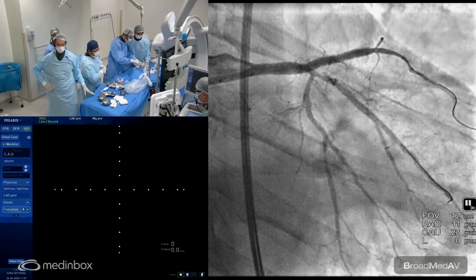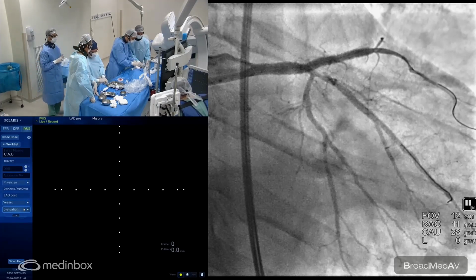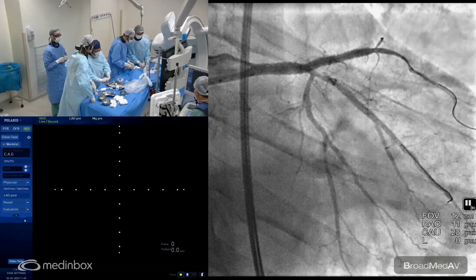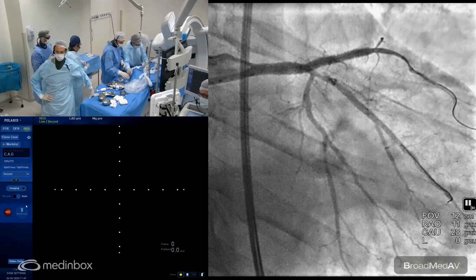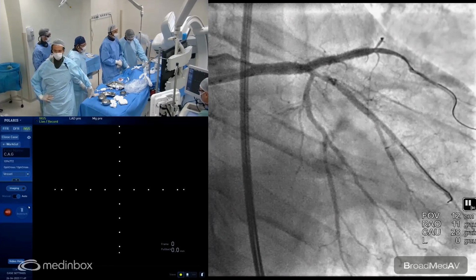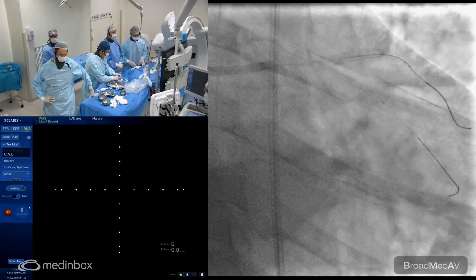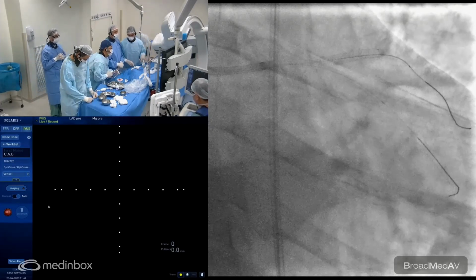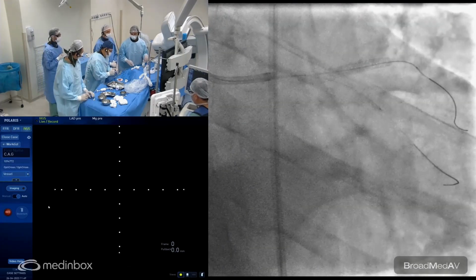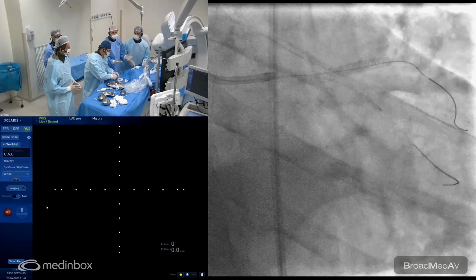So for left main, really, we don't want to take chances. Again, do we need to use IVUS to guide this procedure? Did it help, or could you do it only by angio, like I asked you last week, Ricardo? You can always learn from IVUS, and you can apply what you have learned if you don't have IVUS, and you can optimize. You can use enhanced angio as well to optimize the result. I don't think we need IVUS to know how to do a POT, how to optimize. But if you have IVUS, we can guide with more security.